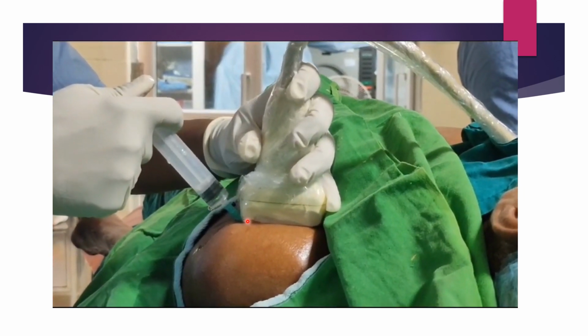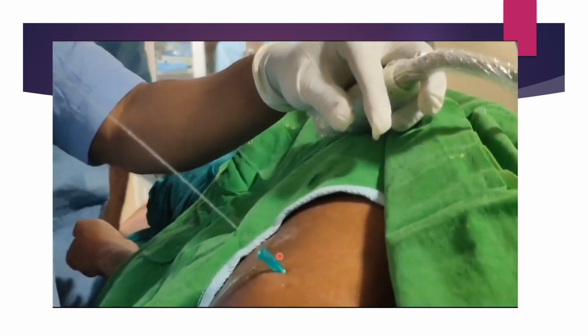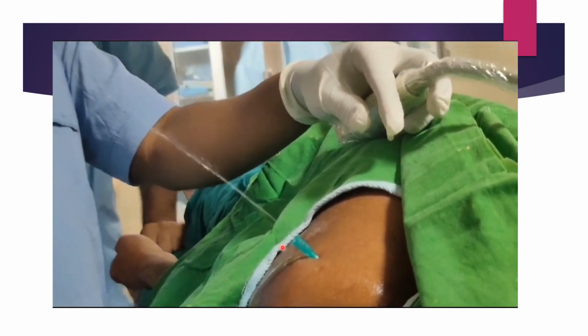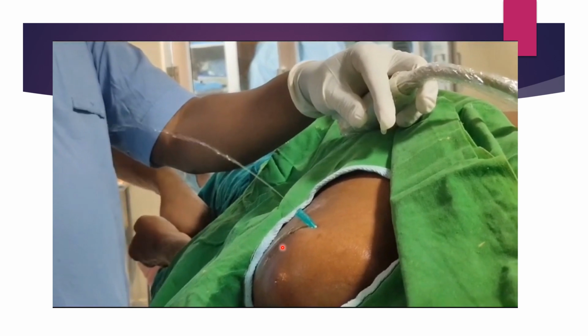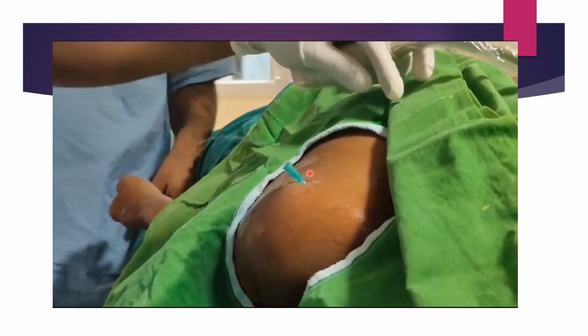So there is a free flow of the normal saline. You could see there is a regurgitant fluid. That regurgitant fluid means that it is confirmatory, it is very much within the joint. Sometimes you may not be able to see the needle tip properly. That is why this particular step is very important.